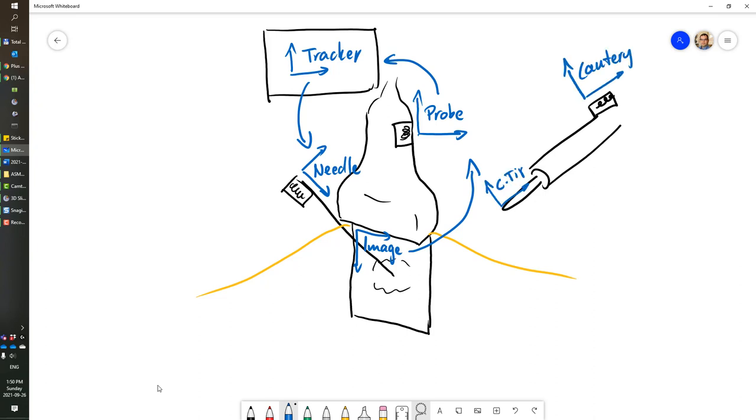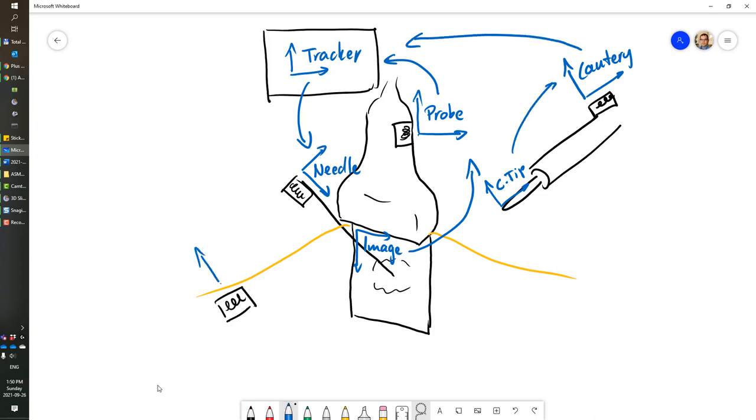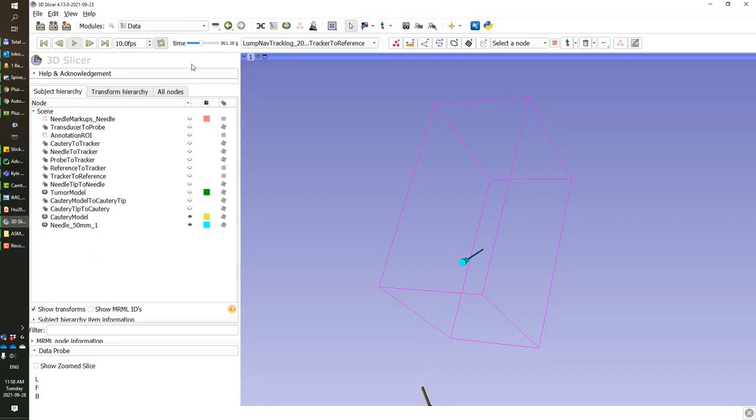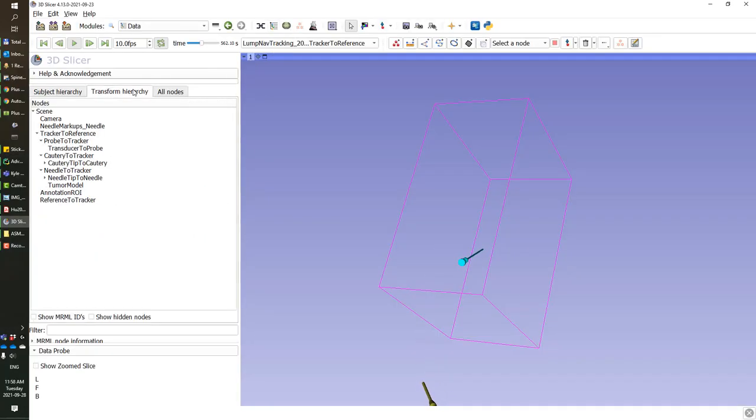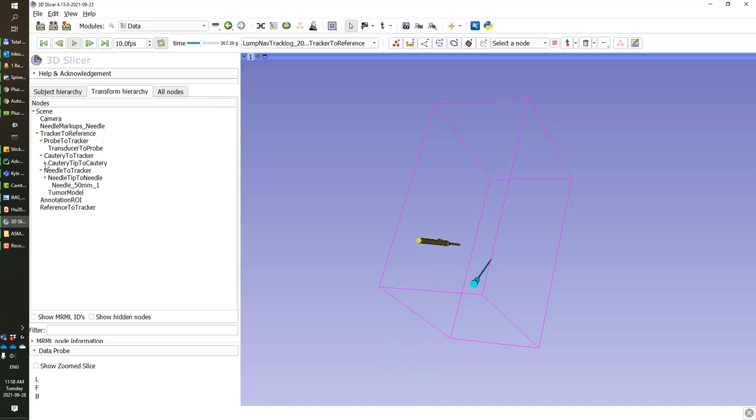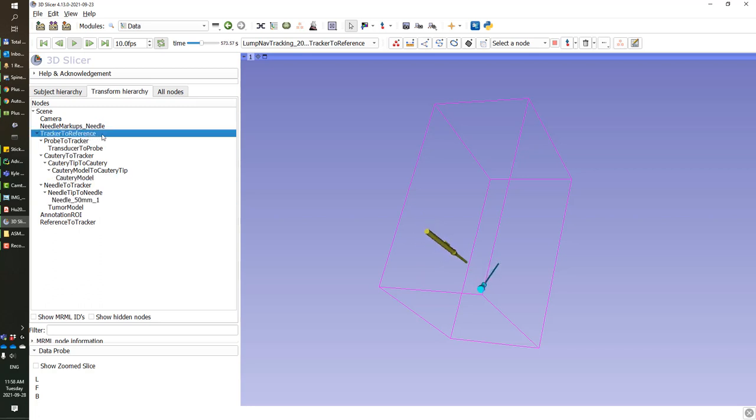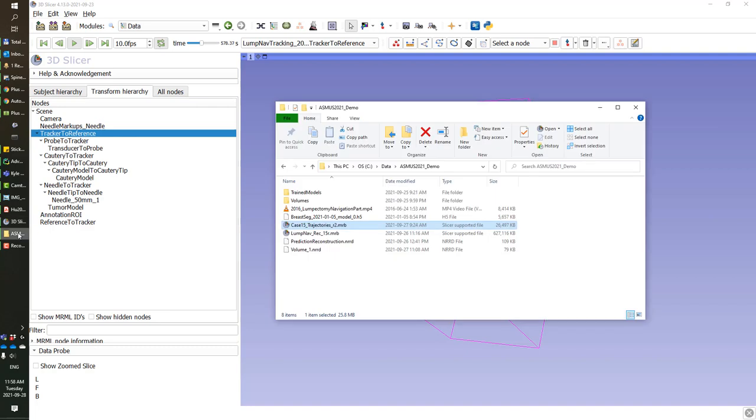The tip of the cautery is what we tracked using an EM sensor mounted on the cautery, and we add a reference EM sensor on the patient as an anatomical reference. And we transform every object to this coordinate system to show them in an anatomical frame of reference. This coordinate transformation system is shown in the transform hierarchy in Slicer. As you can see, all the objects are eventually transformed in the reference coordinate system.